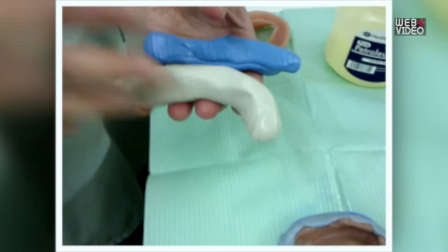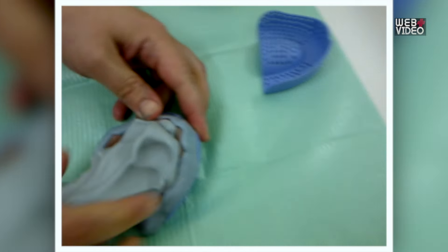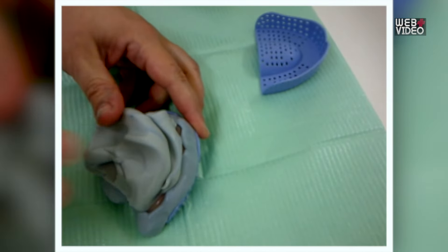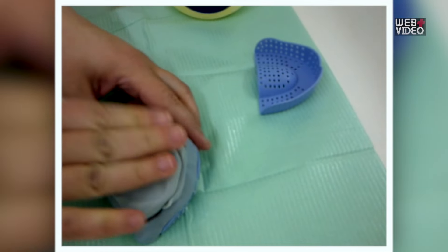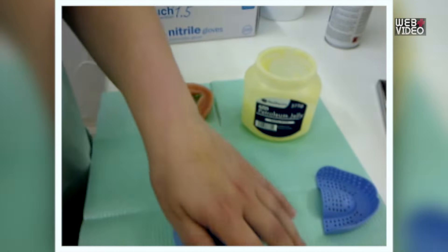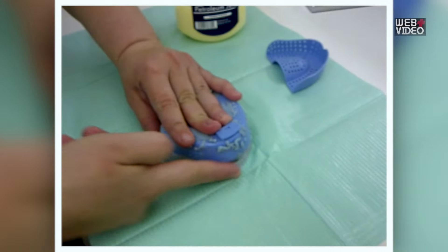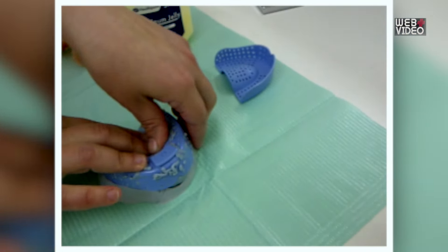Step 3: Mix the remaining white and blue putty evenly and then press it firmly on top of this. Turn it upside down and press firmly, then smooth the edges as shown. Again, you must ensure the putty covers all contours of the denture and that no gaps are left in between.